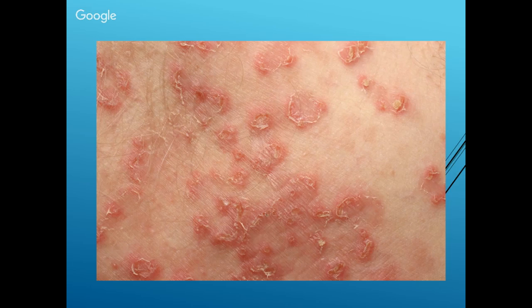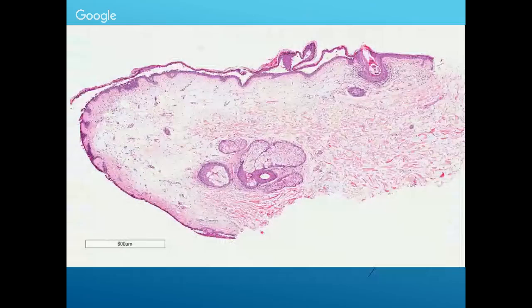So case 7 is the one we're talking about, the vesicular-bullous. Now we are moving on to the next reaction pattern, because otherwise we'll not complete today also. We'll have to rush. So what do you see here?